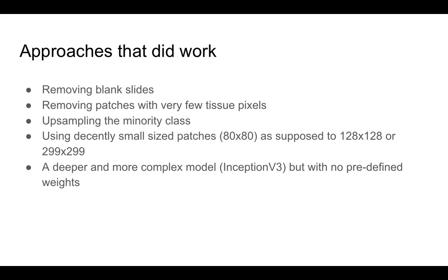Lastly, using a deeper architecture with no predefined weights. I used Inception v3 with no predefined weights in conjunction with all of the above pre-processing techniques, which increased my F1 score by at least 40% points.